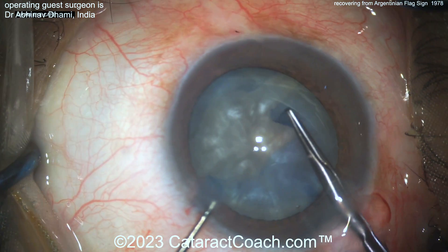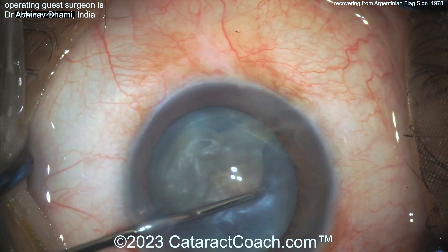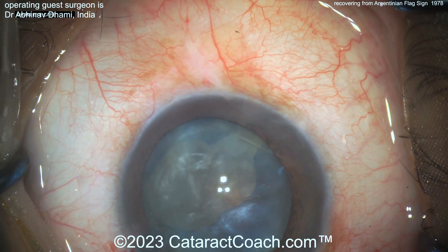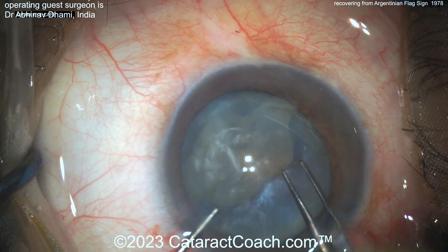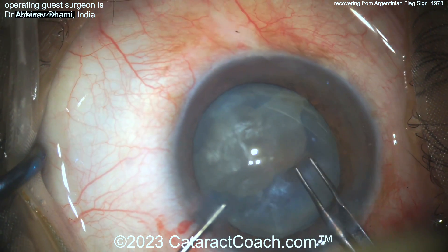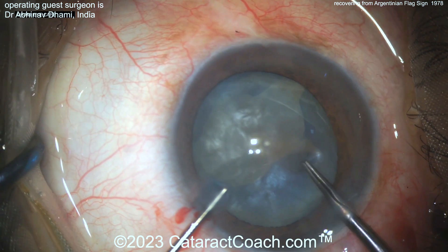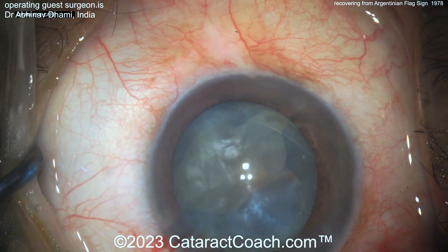If you just go in and poke — as was done here, and we've all made these mistakes, so I don't blame anyone — you're going to have the Argentinian flag sign situation. You can make some cuts in the capsule and try to do some scalloped edges to get the opening a bit bigger, but you still have a huge risk that the rip toward the zonular support can go all the way around the lens equator and back to the posterior capsule, ripping it wide open.